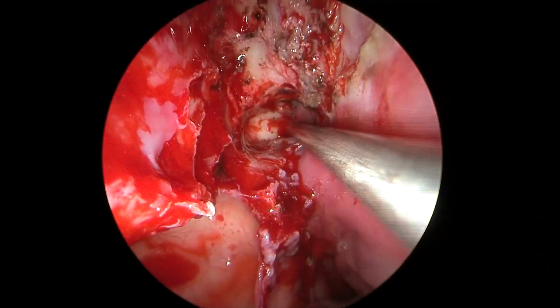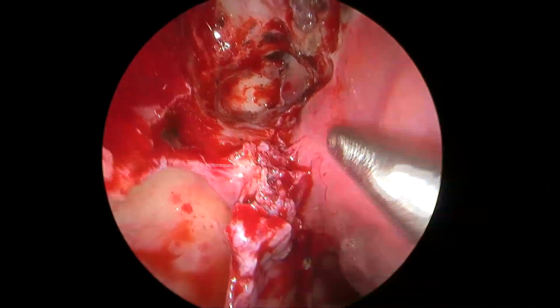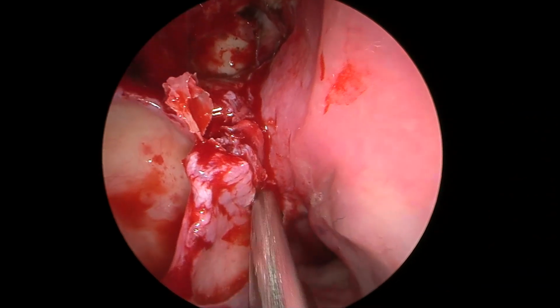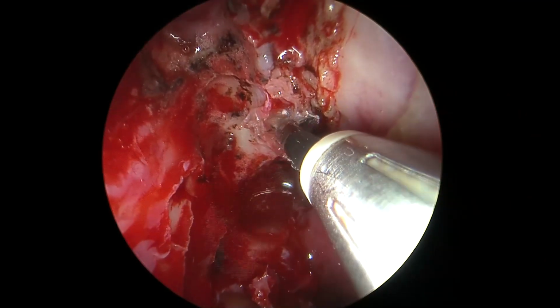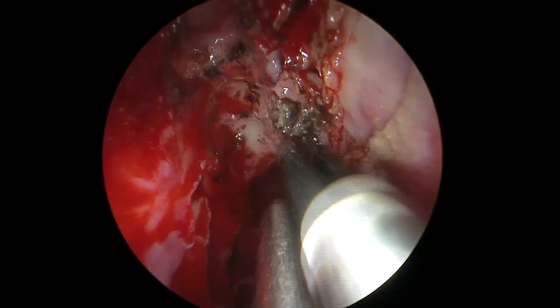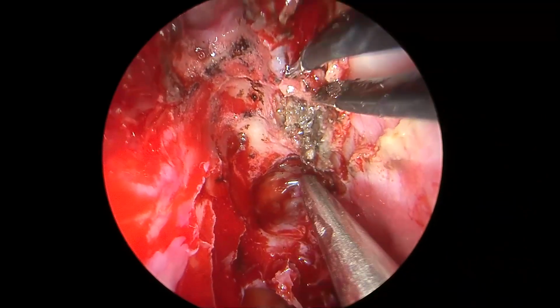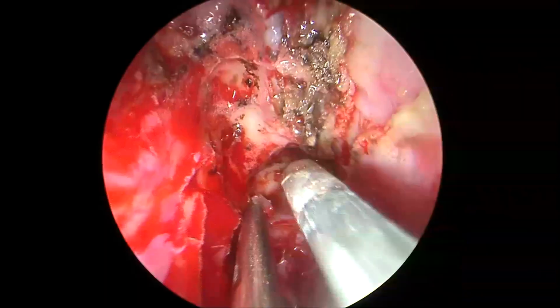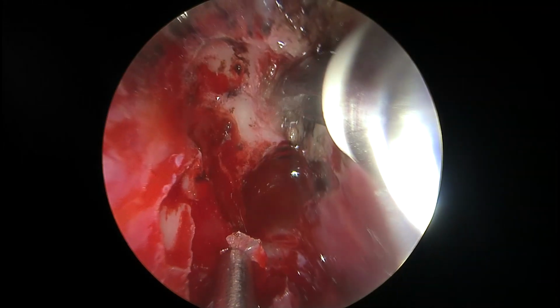Now you see a wide sphenoidotomy here. The sphenoid is clean. You can see a broad septal flap clean and in place. Should there be a future need for a septal flap on the same side, that's always our preference, not to use up anything that we don't need to. Now we are further bipolar coagulating the residual meninges at the location of the skull base defect, which is now to be closed. Once we have done that, we will use our fat to obliterate this.